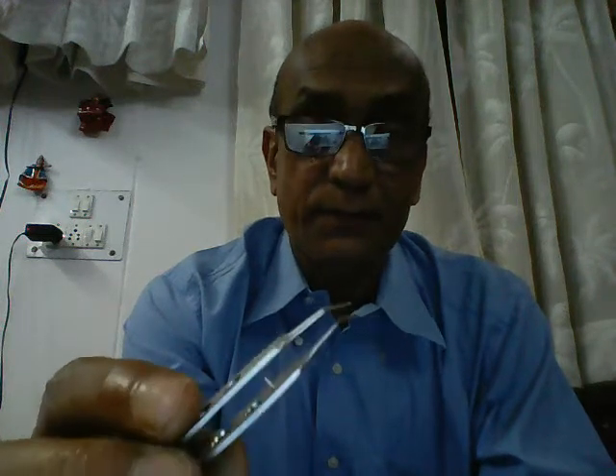These instruments that you see in my hand, this is referred to as the Kelman McPherson IOL Forceps. The function of this instrument is basically to hold the intraocular lens at the haptic-optic junction and to insert it into the capsular bag.